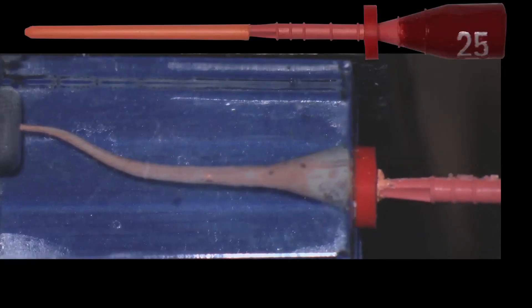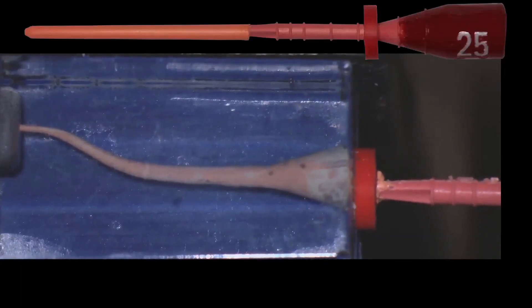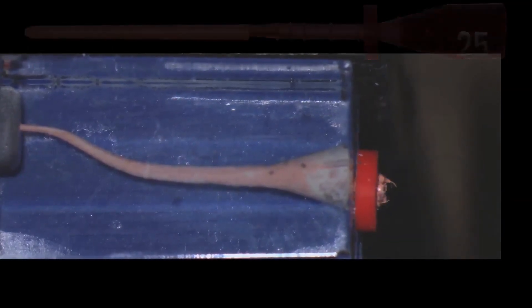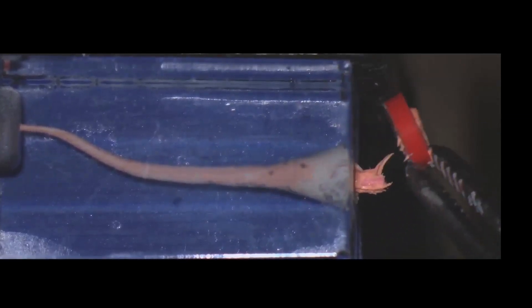WaveOne Gold will also have paper points, gutta-percha points, obturators, and size verifiers that match the taper of WaveOne Gold. After you have seen the use of WaveOne Gold on a plastic block, let me take you through a clinical case.